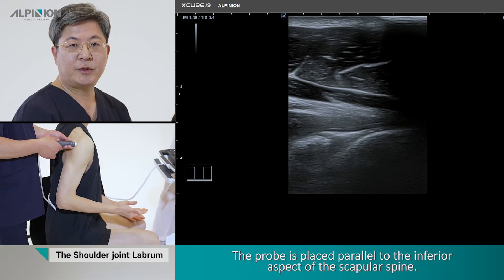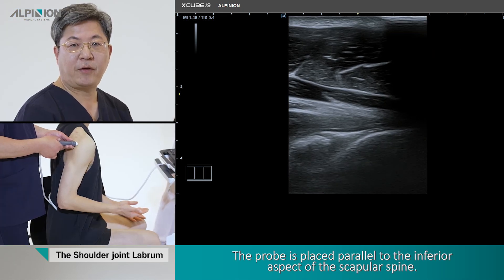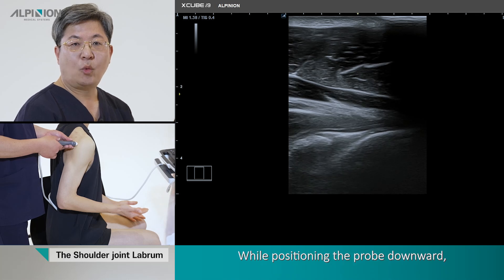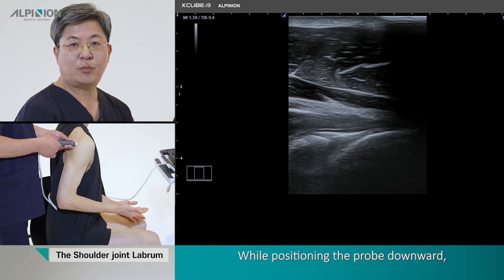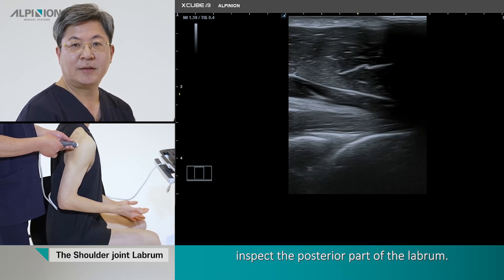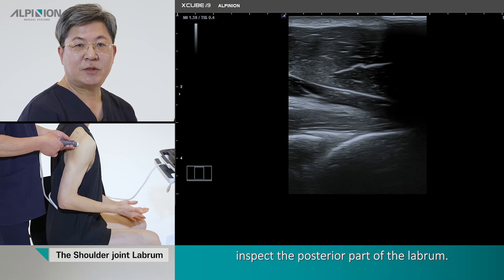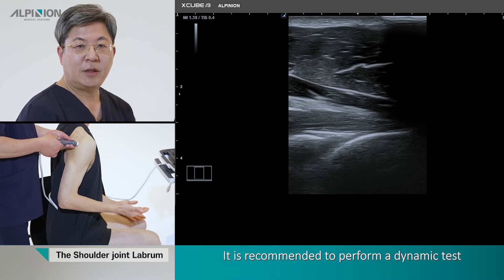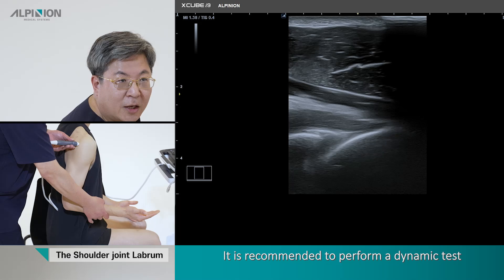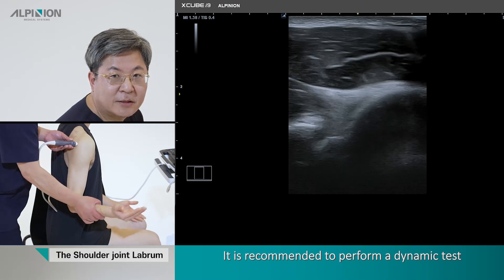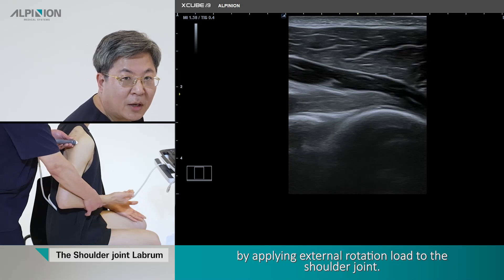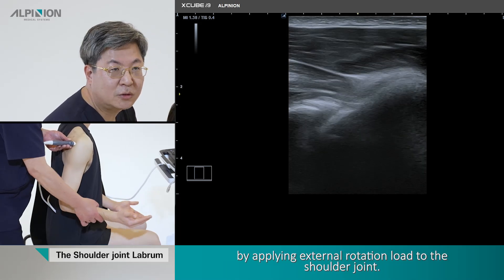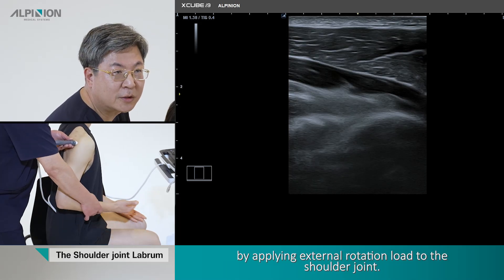Posterior labrum. The probe is placed parallel to the inferior facet of the scapula spine while positioning the probe downward to inspect the posterior part of the labrum. It is recommended to perform a dynamic test by applying an external rotation load to the shoulder joint.